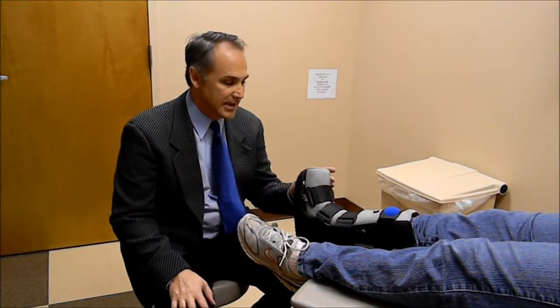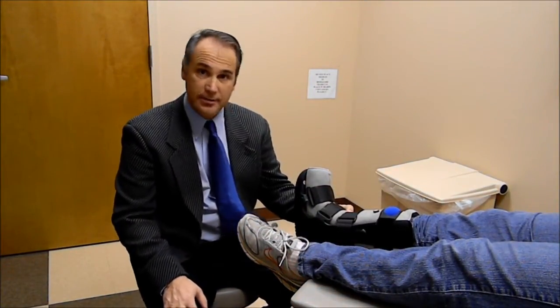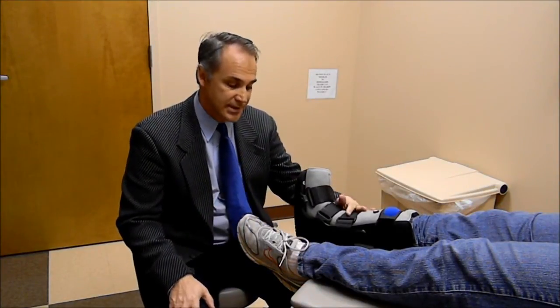What we have here is a patient who has injured her ankle and we're putting her in a fracture boot to rest the area.